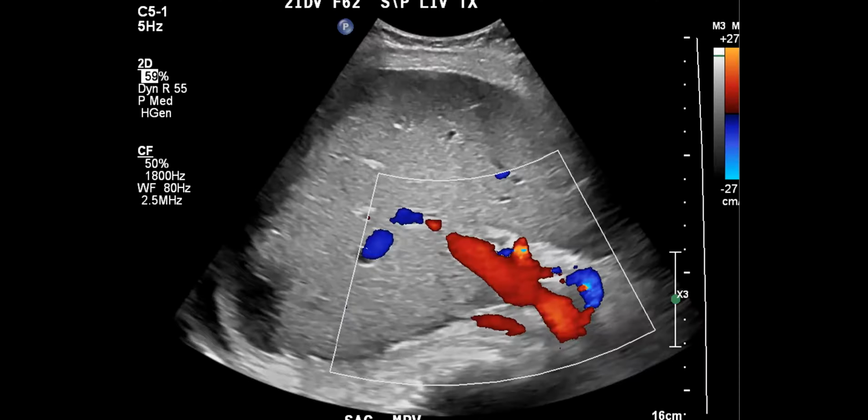What is it from? Is it just rejection? I think it looks like the vessels were patent. Yeah, it must be. The patient also had a splenic infarct, although not as big, and the patient also had a right adrenal infarct. Hold on, I'll show you.